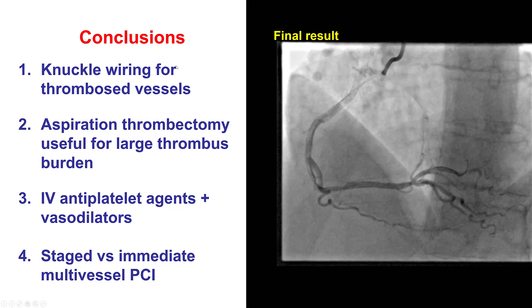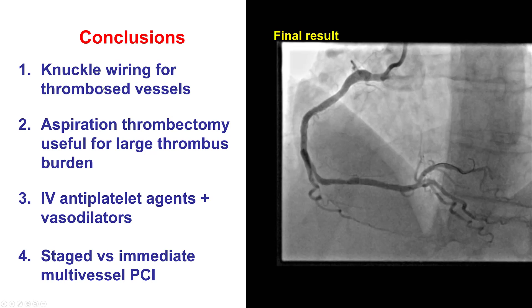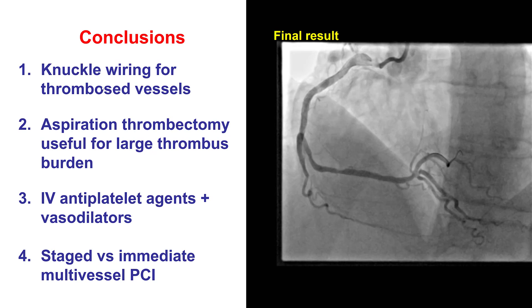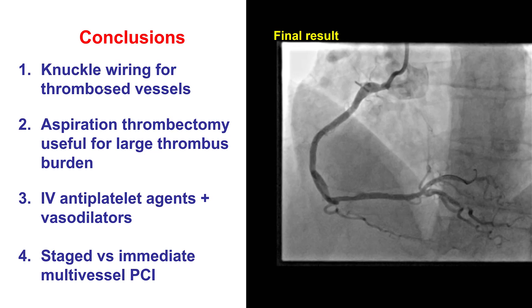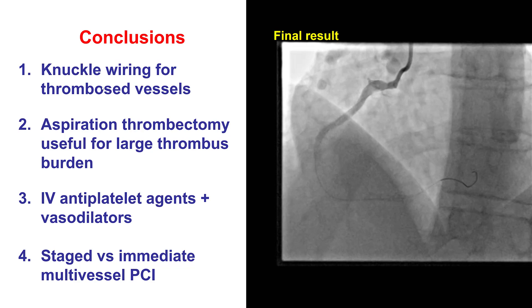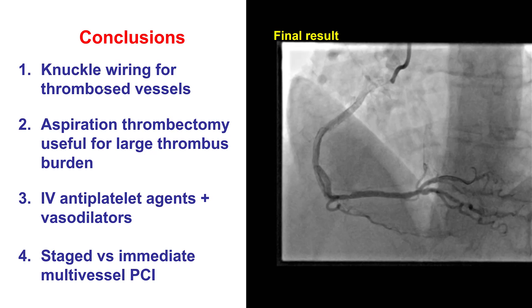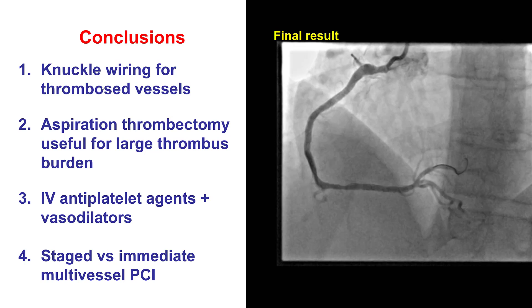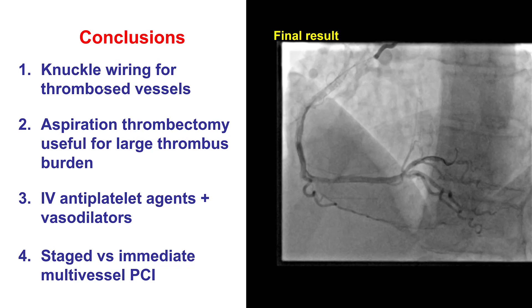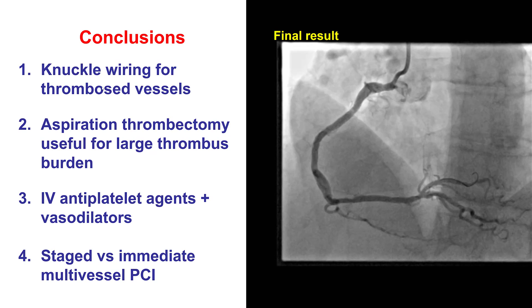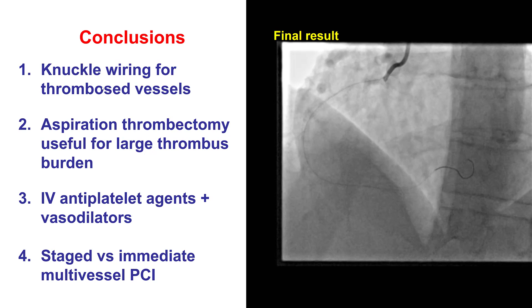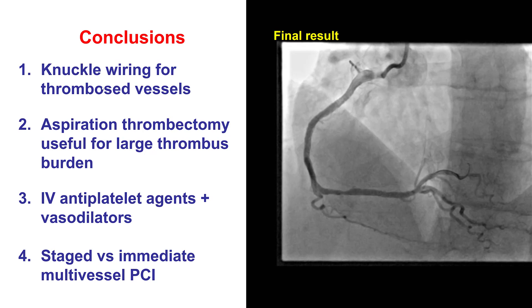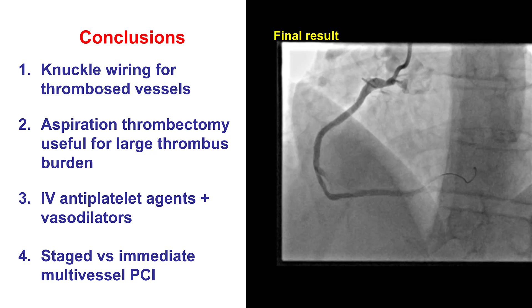Several teaching points from this case. The first is how to wire thrombosed vessels. This case illustrates that using a workhorse guide wire and advancing the tip looped in a knuckle configuration can be a useful and safe way to navigate through an area of thrombus with low risk for perforation. Sometimes a polymer jacket wire like a Fielder FC or SC or Sion Black can be used instead of a workhorse, especially when vessels are calcified.